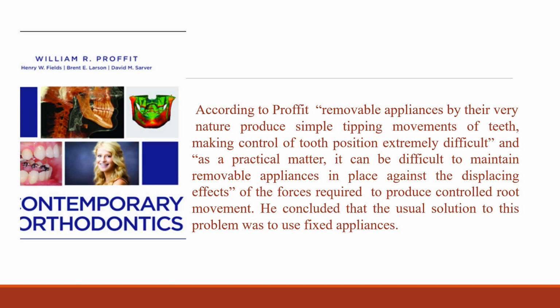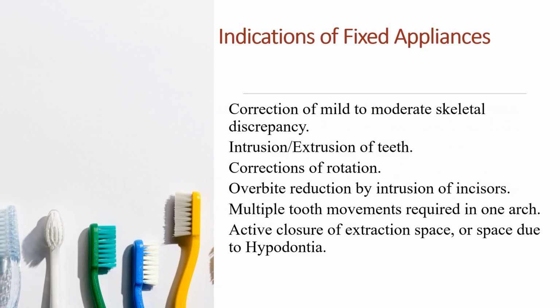The predominant fixed appliance system in use today is based around a bracket with a rectangular edgewise slot and inbuilt prescriptions for each individual tooth position. A number of modifications on this basic design now exist, largely concerned with the method of attaching the arch wire within the bracket slot and either positioning the bracket on the labial or lingual surface of the tooth. However, another group of fixed appliances, light wire systems, have also been developed, which allow much greater amounts of tooth tipping during the early stage of treatment.